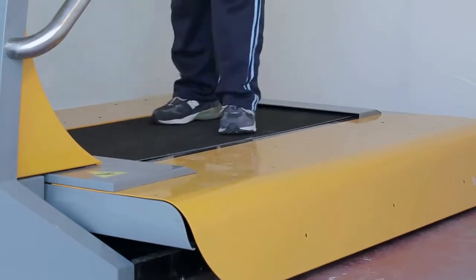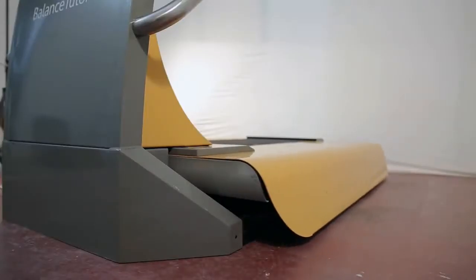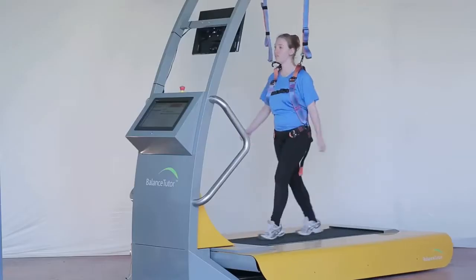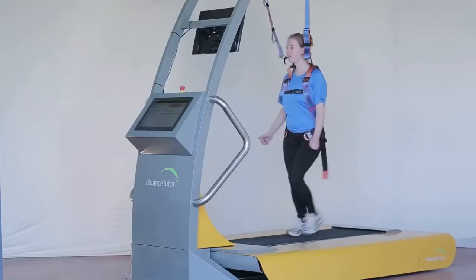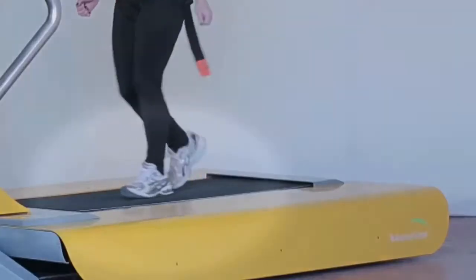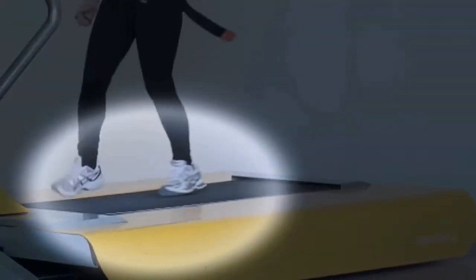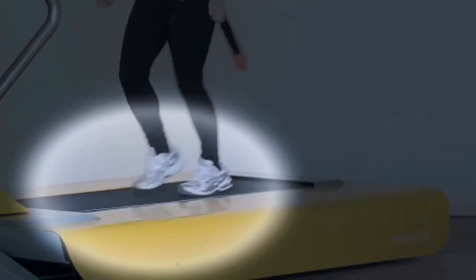The system consists of a treadmill mounted on a moving force plate platform. The platform moves in the medial-lateral and forward-backward planes to simulate a slip and a trip in both the static and dynamic mode.